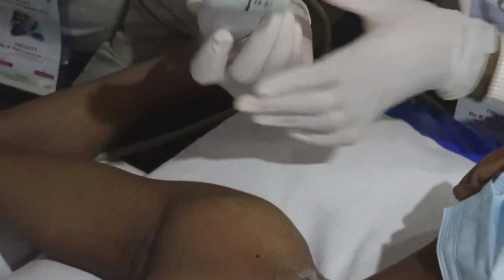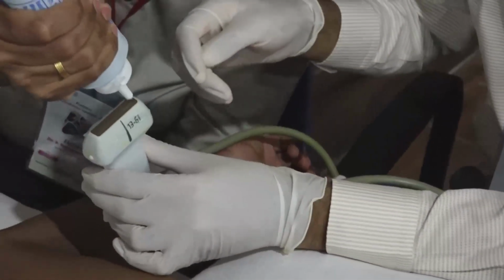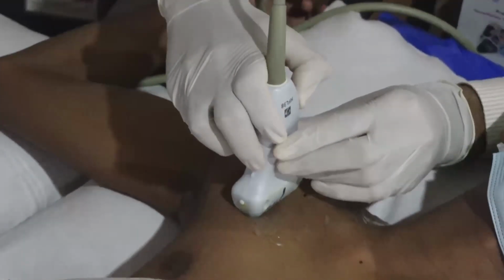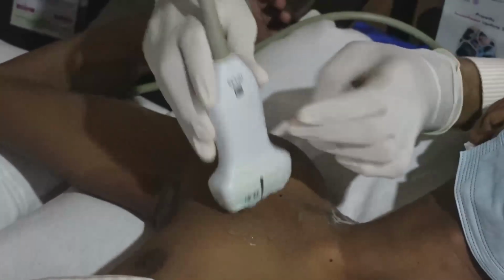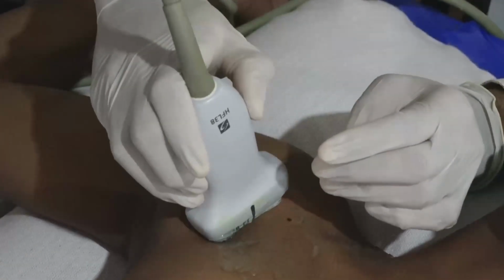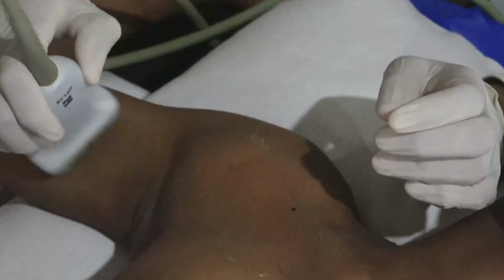So now I will move on to the axillary area. I'm holding my probe vertically and I'll move towards the axilla.